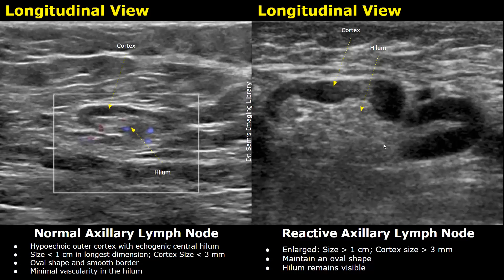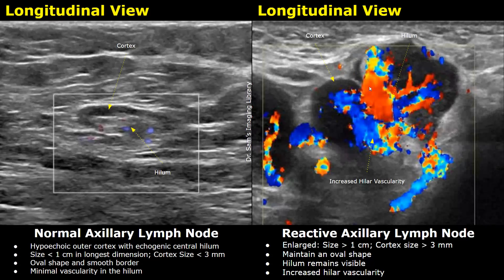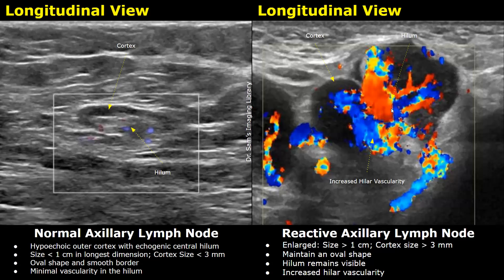When Doppler is applied, we will see increased hilar vascularity — this is another feature of a reactive lymph node. We can see increased Doppler signals compared to a normal image, where we see very few Doppler signals. This increased central vascularity is a sign of a reactive lymph node.